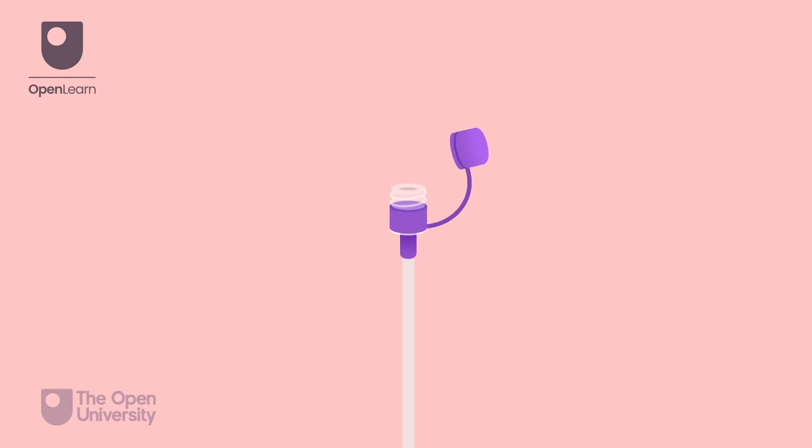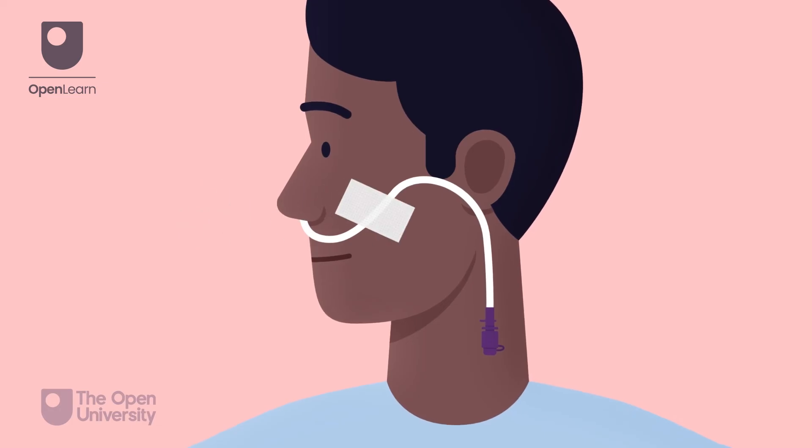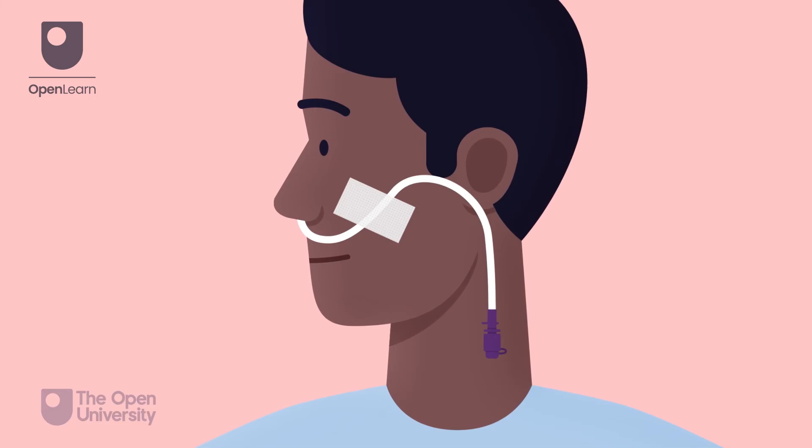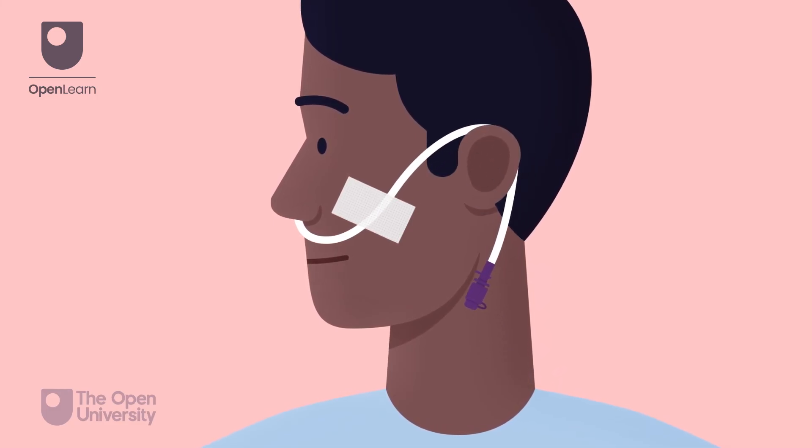Remove the guide wire and close the port. Secure the tube to the person's face with tape as per local policy. If possible, loop the tube over the ear to distribute the weight away from the tape.